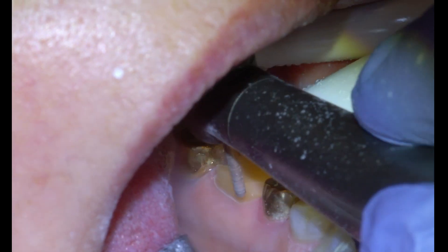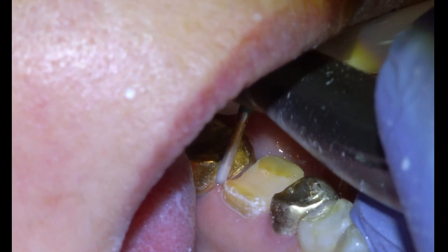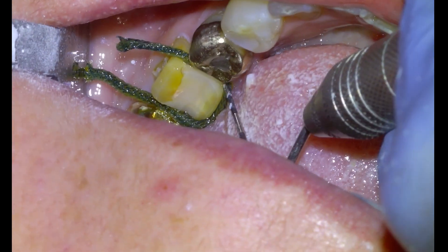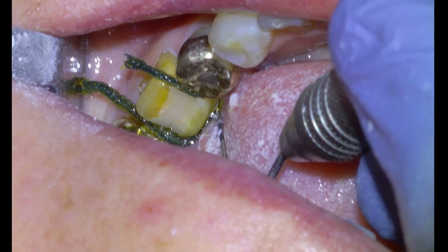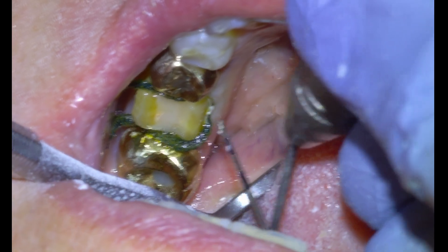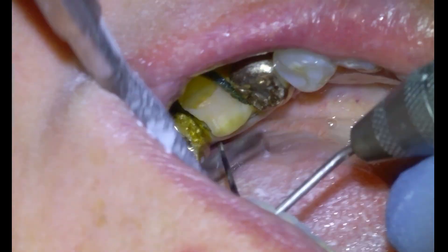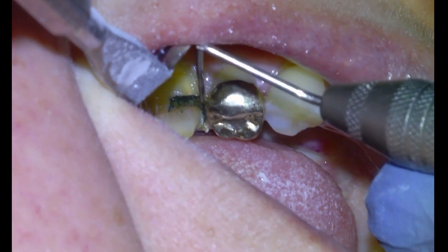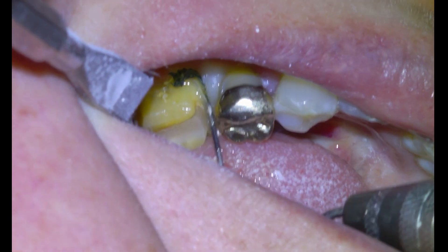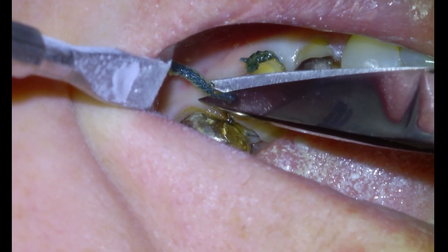We're pretty much finished with our gross reduction, so we're just going to round off this little corner and then begin retracting the gum tissue with a size one ultra pack retraction cord. I like to use a perioprobe to do cord retraction because it keeps my tray set-up nice and minimalistic. We only need to retract from the mesial interproximal to the distal interproximal since the buccal surface was supragingival. I'll use size one cord 95 percent of the time unless I'm working on lower anteriors.